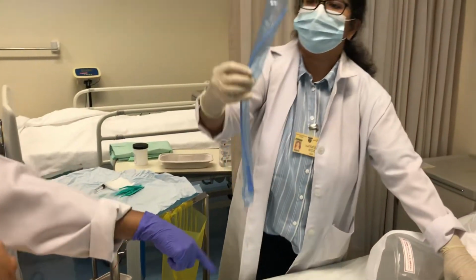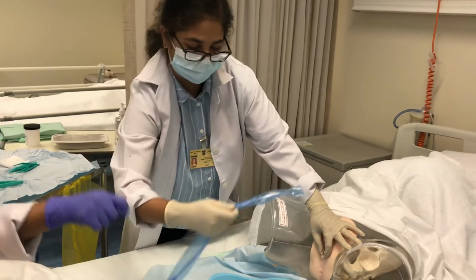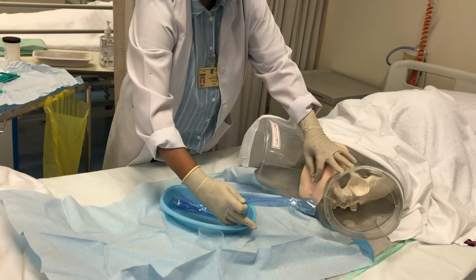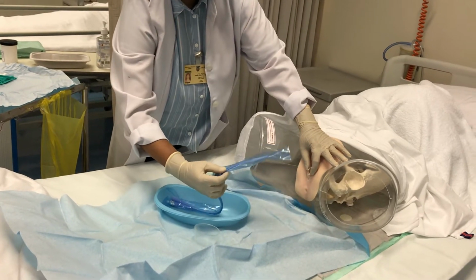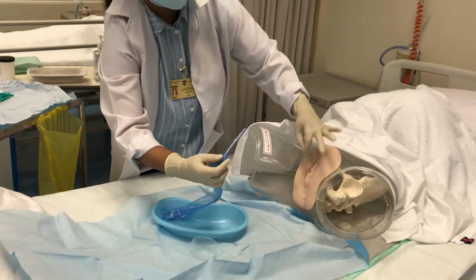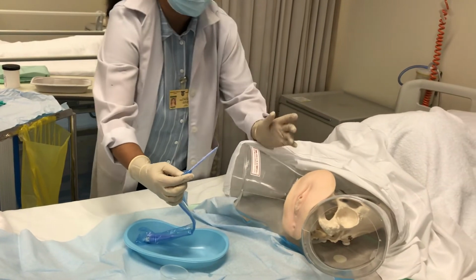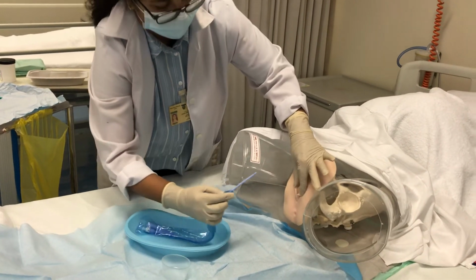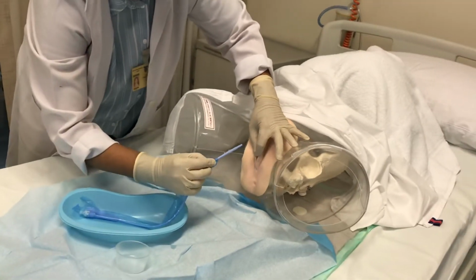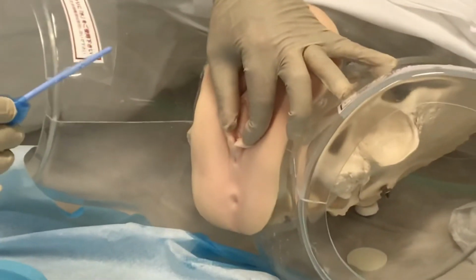Now already we have lubricated and kept the end inside the receptacle, so that any urine dribbling will go down. What I will do is, we will not still remove the cover. We are going to remove it as we are inserting. So as much as possible, we are protecting it from infection. Two to three inches away from the tip we are holding. But the patient needs to take a deep breath, and while exhaling, we will insert.